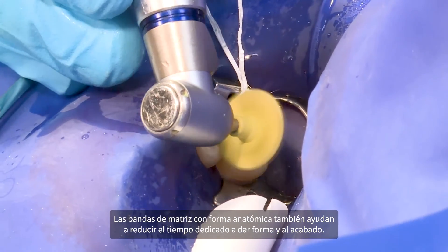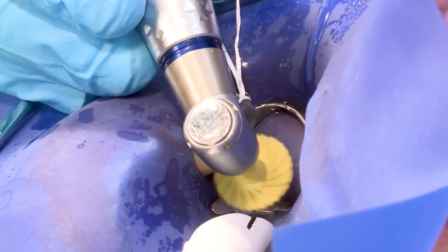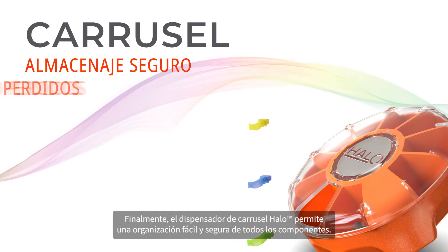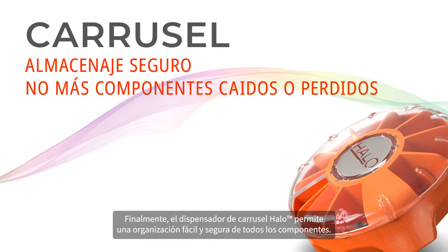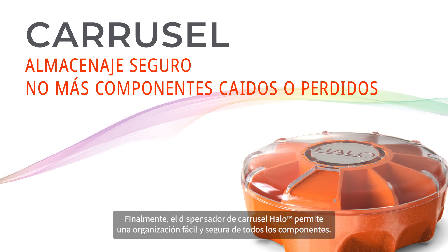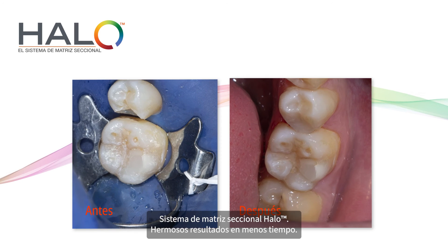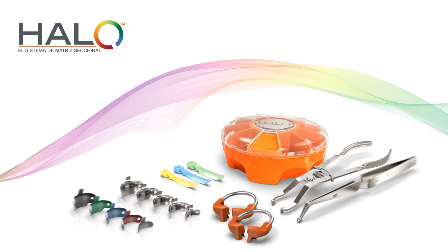The anatomically shaped matrix bands also help reduce the time spent on shaping and finishing. The HALO carousel dispenser allows for easy and secure organization of all components. HALO sectional matrix system – beautiful results in less time.